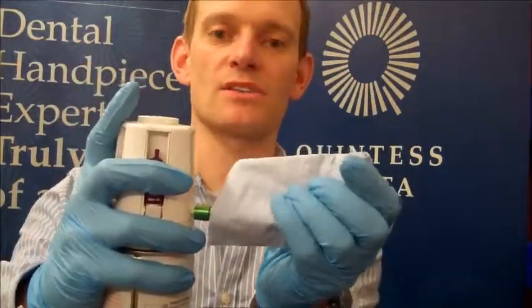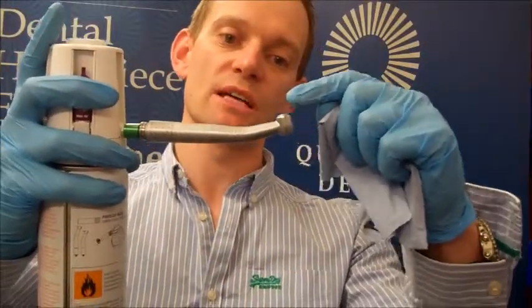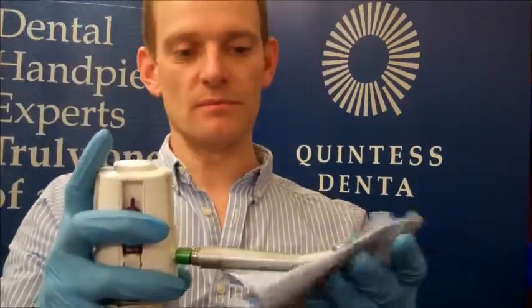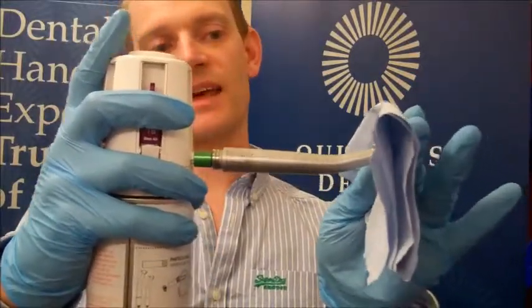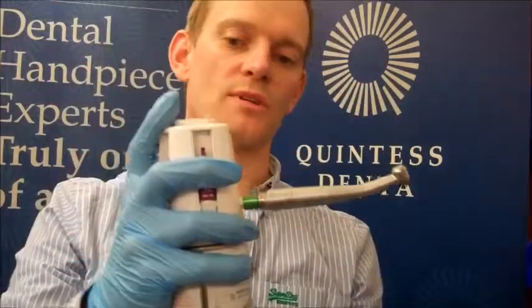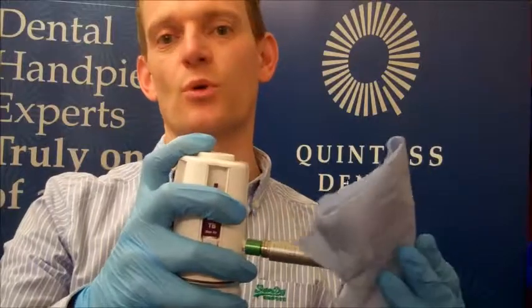So what you should see here, now normally you will have this covered in when you're spraying, but I want you to see that the spray should be coming out the back cap and also at the where the burr enters there. So apply a little bit of pressure to the end of the head, so that if there is a bad connection here, it doesn't blow off and damage the handpiece. You want to be spraying for 4 to 6 seconds.